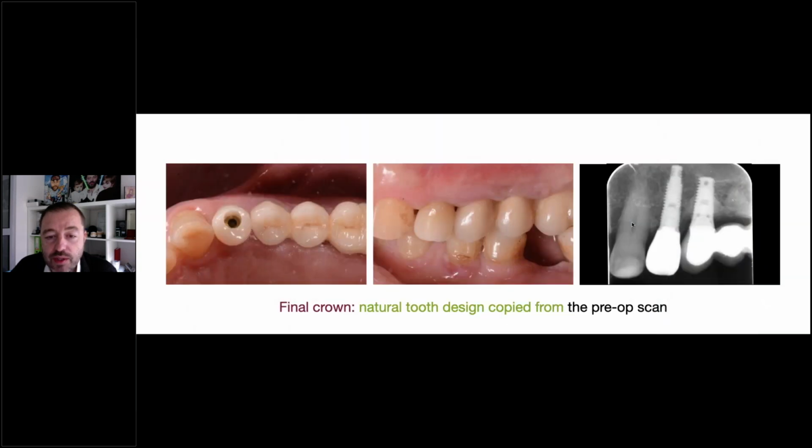And here is the final restoration, and you can see how nice the crown on the X-ray is adapting directly on the implant shoulder. And you can see that the nearby implant is the classic tissue level implant with a cemented crown. So basically, here are the best alternatives for a biological restoration with the matrix and with a cemented crown on an old tissue level implant. So basically, we were able to obtain the same advantages without cement, which I think it's huge for nowadays dentistry.